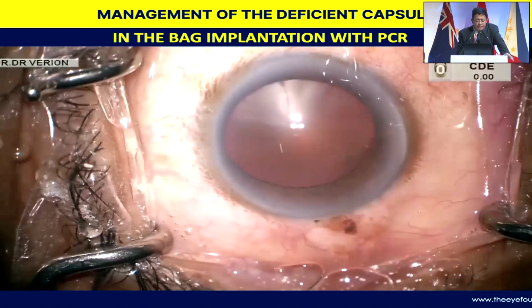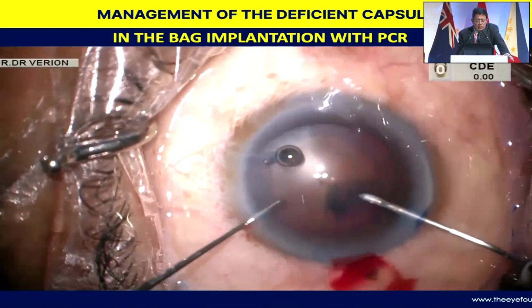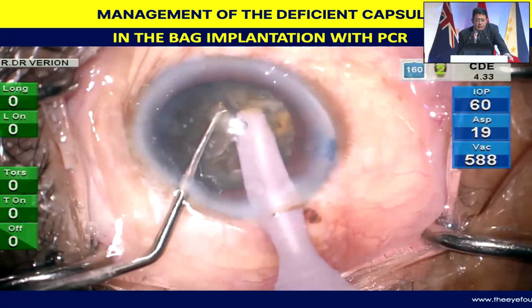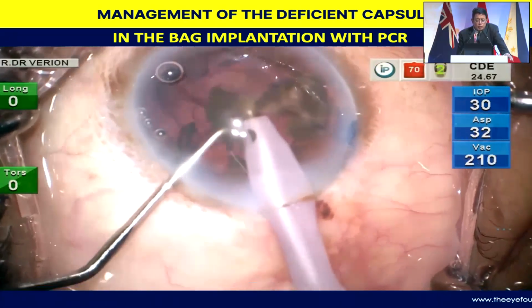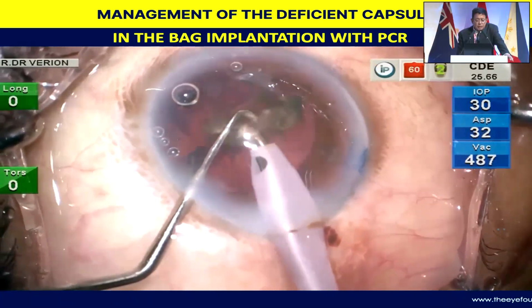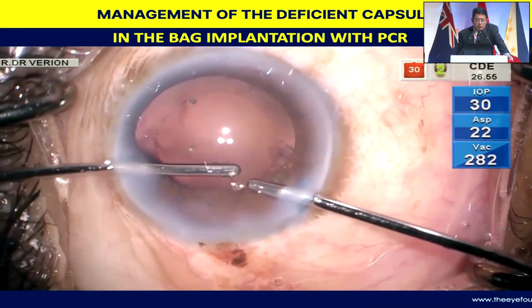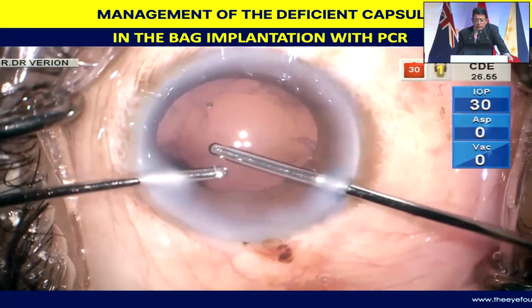In the bag implantation with PCR: you can see all these videos are running at 2x speed, so that's the reason it's a little jumpy. A little hard cataract, basically what I'm doing is a direct chop, and all the maneuvers seem to be going quite well. My phaco probe remains steadily in the center, the nucleus fragments are flowing in, but then as I proceed with the surgery, as was pointed out earlier, there was a surge, and I do have a PC rent, which will become a little more obvious. It's right over here, and you can see it in this area.